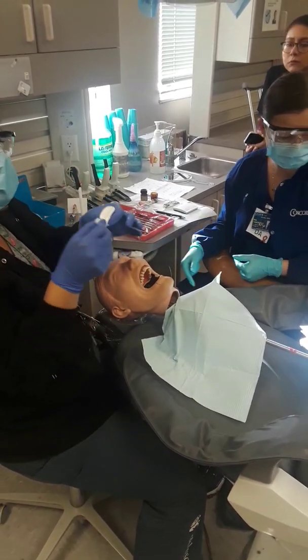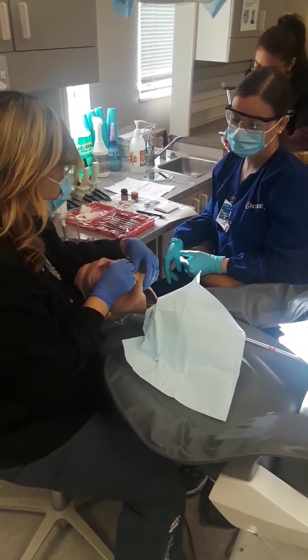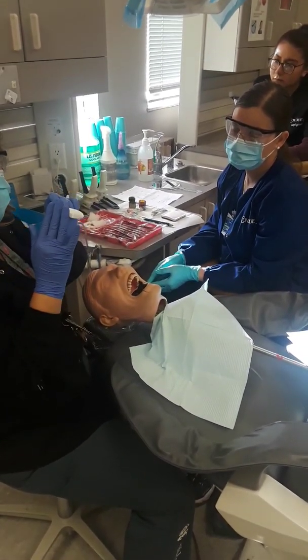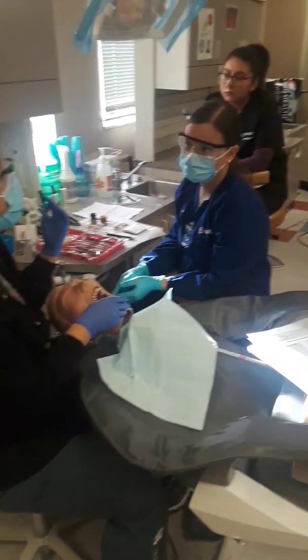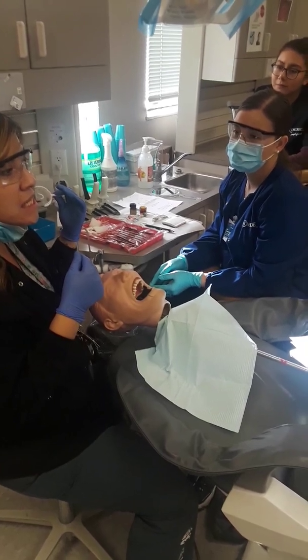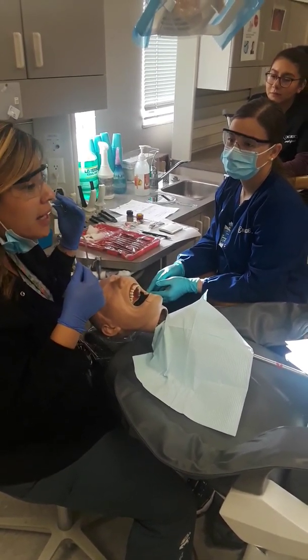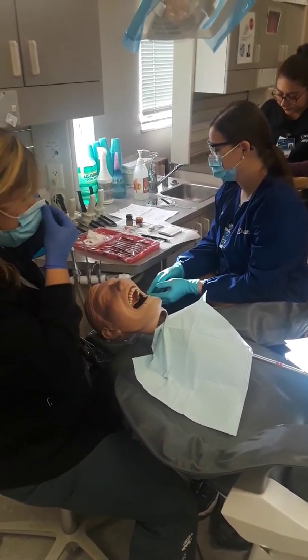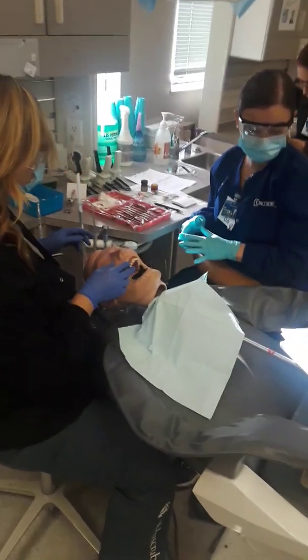And then you always want to try this in so the patient feels this at least one time. So try this in, have the patient bite with no material in there, and then now he knows what that feels like when we put this in, because if he bites wrong on this tray when we do a final impression, it will throw the crown bite off completely. So you always want to make sure you say bite normally, because it's funny, watch, when you go into an office, you tell a patient to bite down, they bite, and you're like, where did that come from? No, bite normal. And they're like, is that how you normally bite? Oh no, I bite like this. You'll get that all the time, I promise. So I always want to practice them biting down. Okay, so we tried the tray in and the preliminary impressions were taken.